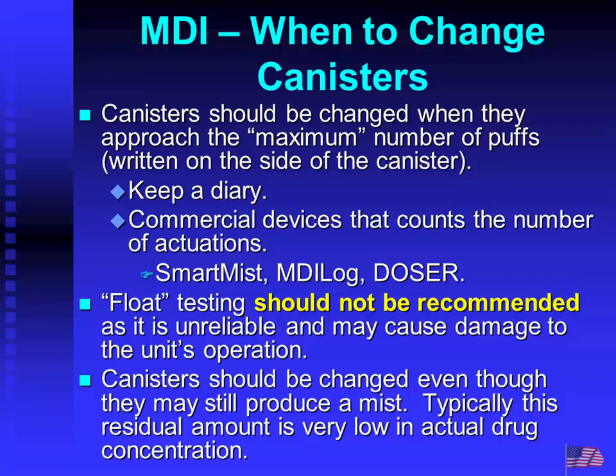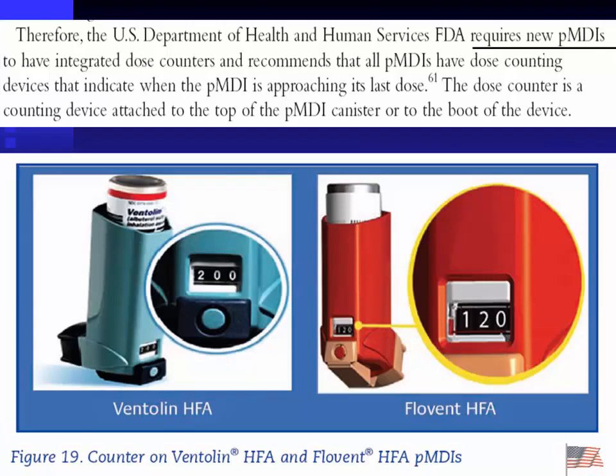We used to recommend doing float testing, and I think Lori might have talked about that. That's been eliminated because it can cause some damage to the unit itself. And even though they may still produce a mist, when you've reached the maximum number of doses, they need to be changed out because there's very little medication in those end ones.